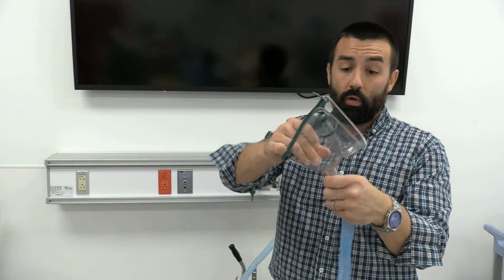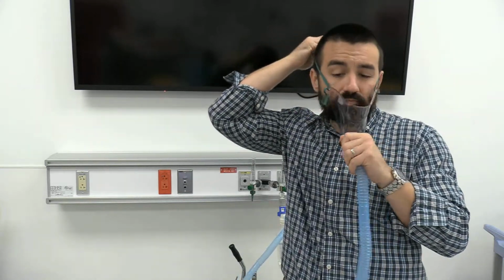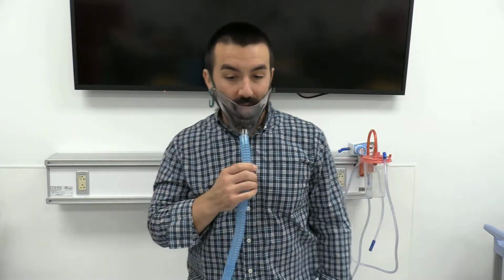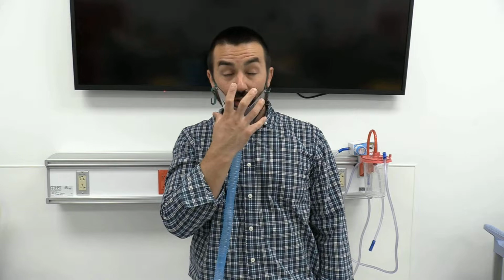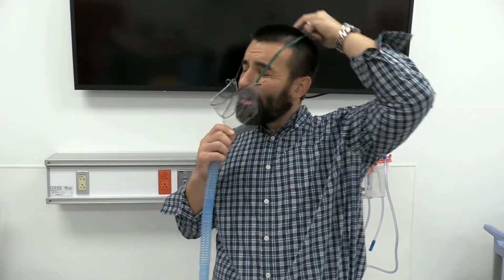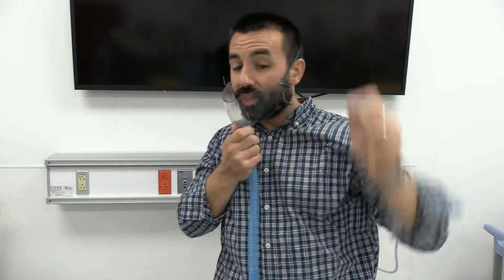The thing people do wrong, and I've never understood it, is they'll do it like this, and you'll come in and you'll see the person's, in my case, my beard would be dripping with water. I'm not really fully getting that gas. And likewise, I don't have everything up around my nose and my mouth, so it's a little bit more difficult for me to truly ensure that I'm getting what I need here, okay? So always make sure you think about where that gas is going.